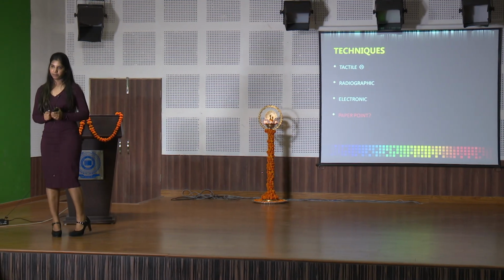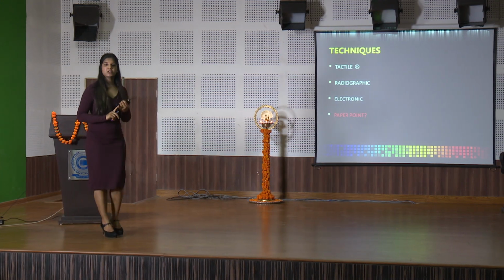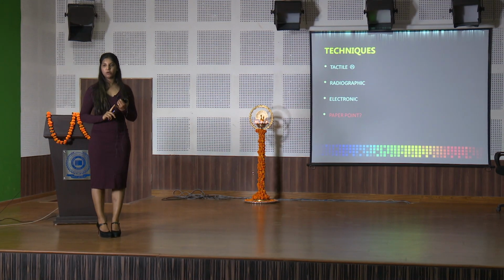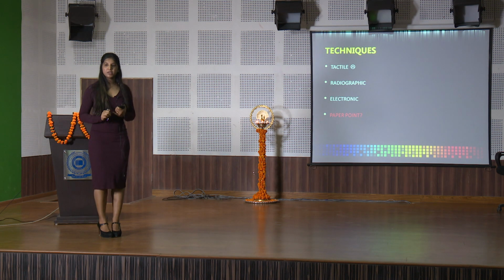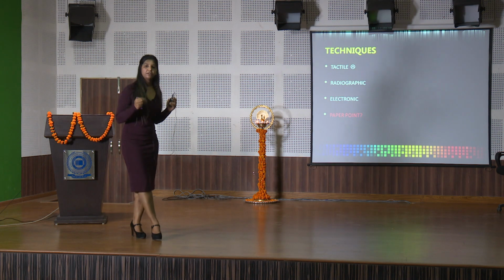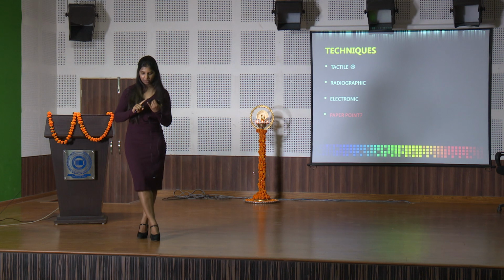What you need to remember is, number one, never stop short or beyond the apex and say, okay, I'm 1 millimeter short of the apex, this is 18, so the working length has to be 19, alright, assistant can remove the apex locator. No, because the reading is not literally in millimeters. It is in some form of x, so you don't know what 1x or 2x is. You have to reach 0, and that reading has to be your working length reading. So remember that, 1 point.